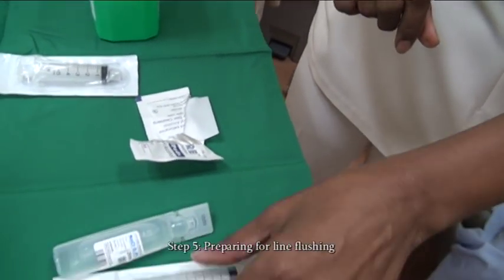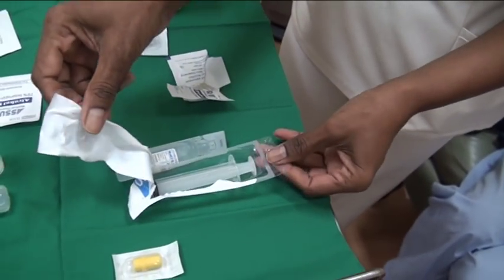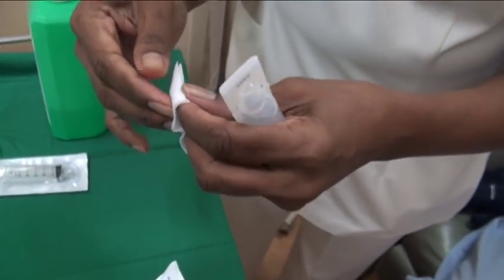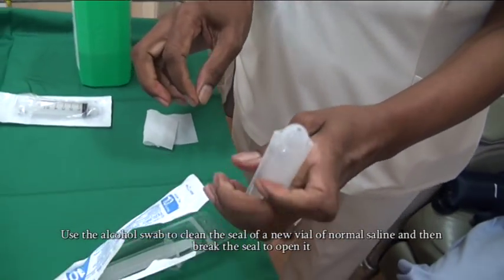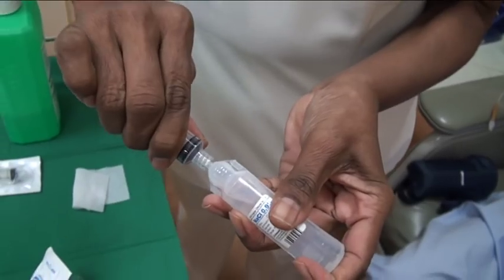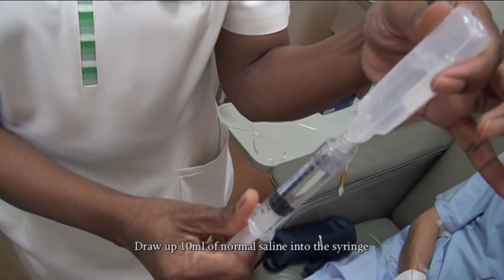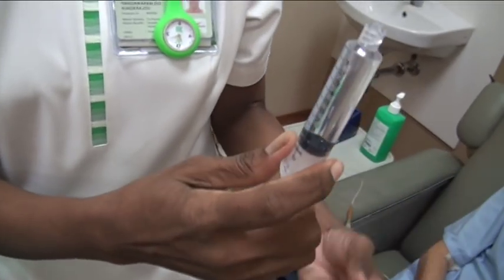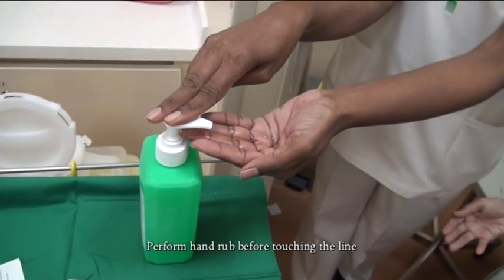Step 5: Preparing for line flushing. Open a new alcohol swab and then open a new 10ml syringe. Use the alcohol swab to clean the seal of a new vial of normal saline and break the seal to open it. Draw up 10ml of normal saline into the syringe. Expel any air that is in the syringe. Replace the syringe back in its pack. Perform hand rub before touching the line.